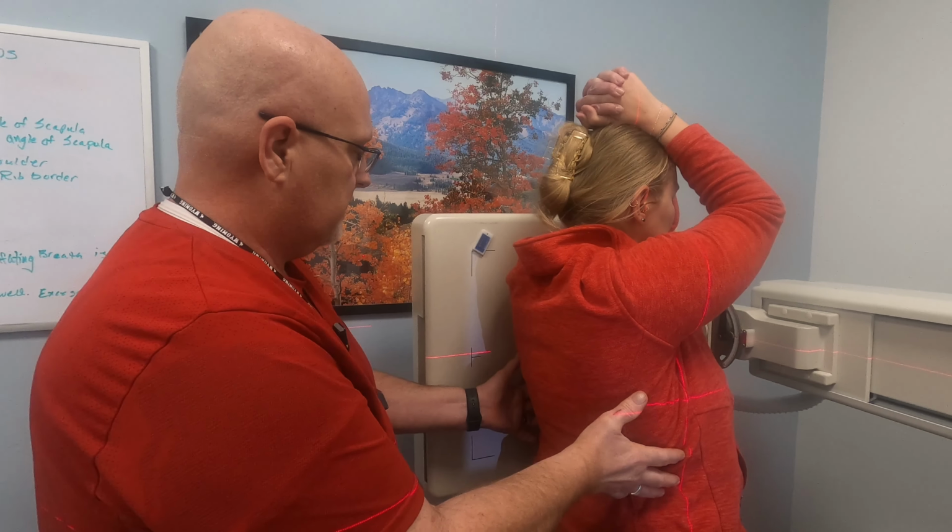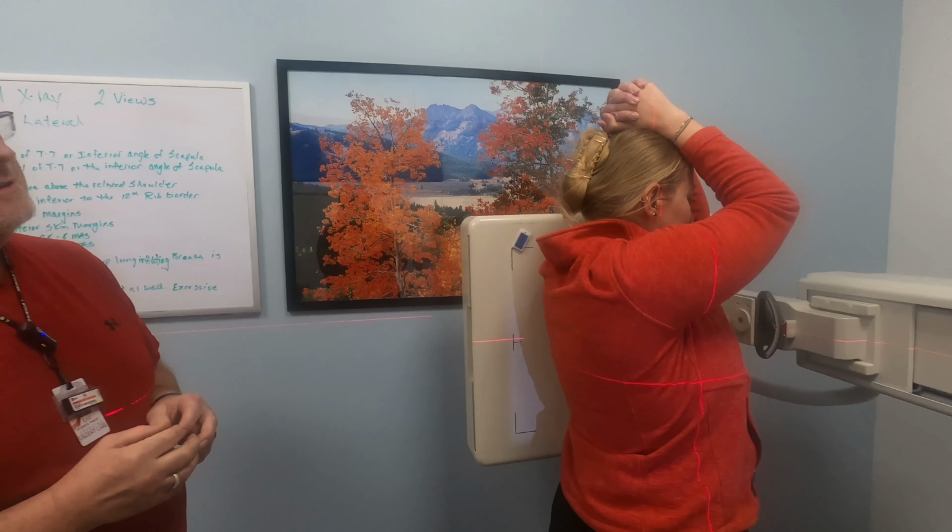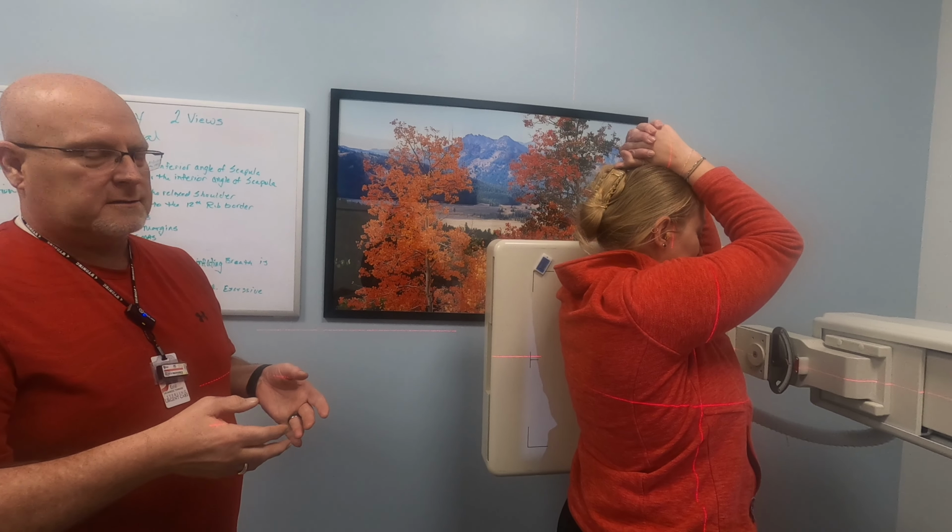Again, we're gonna do the second inspiration breathing technique. So we'll have Kate take a deep breath in and blow it all the way out. Another deep breath in, and we'll shoot the image, okay? So that is a chest x-ray. We're gonna do a PA and a lateral. Make sure you're doing a left lateral. Make sure you're doing it at 72 inches, very important. Collimate as tight as you can, but make sure you don't cut any costophrenic angles off or the apices of the lung, okay? Anyway, piece of cake, okay?